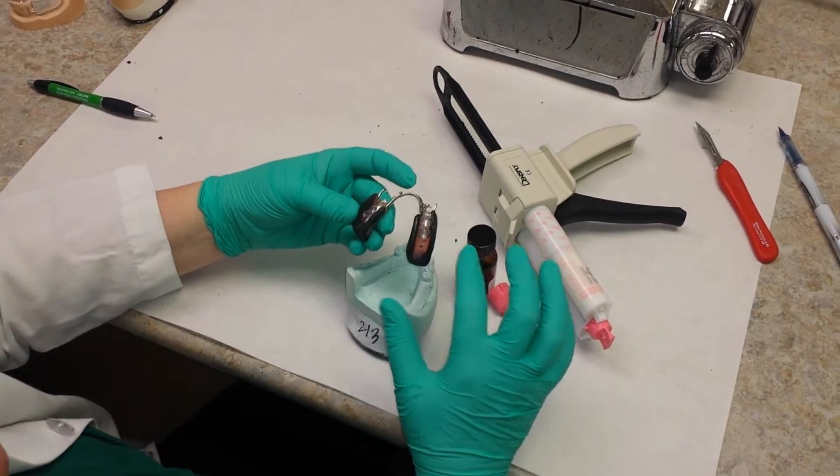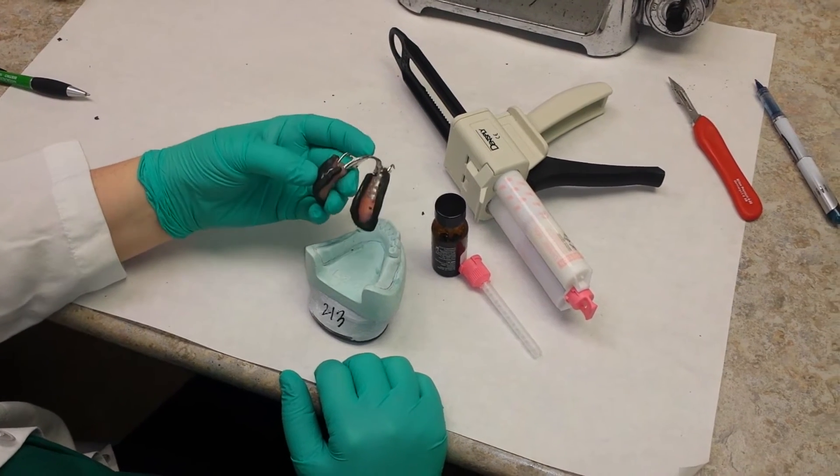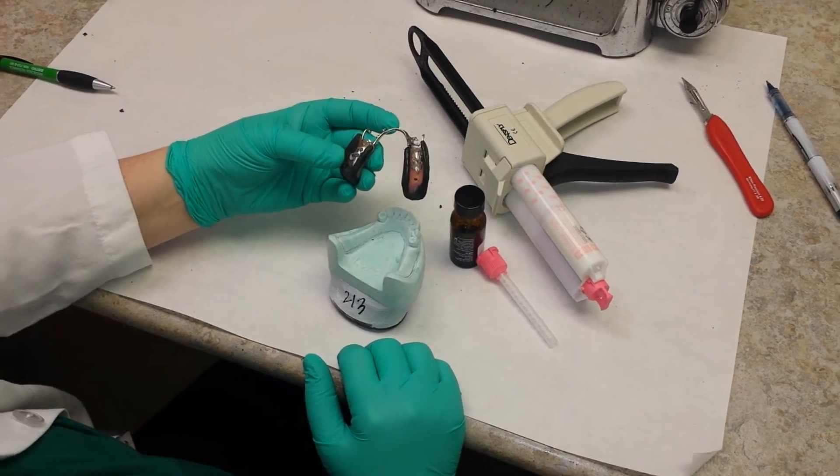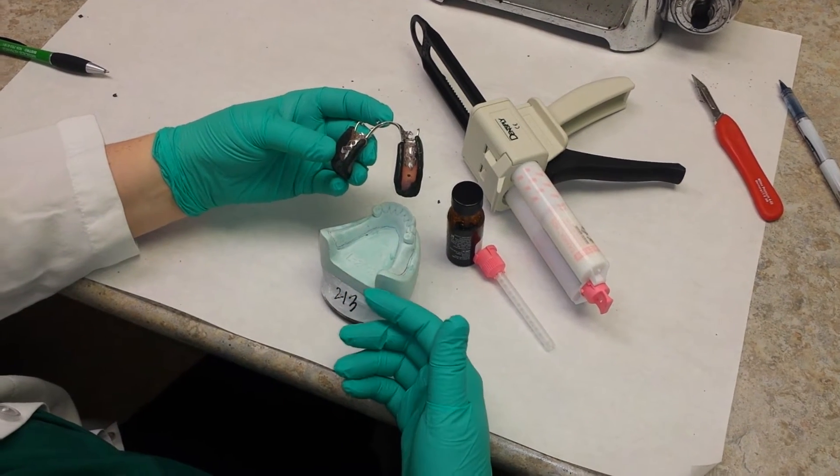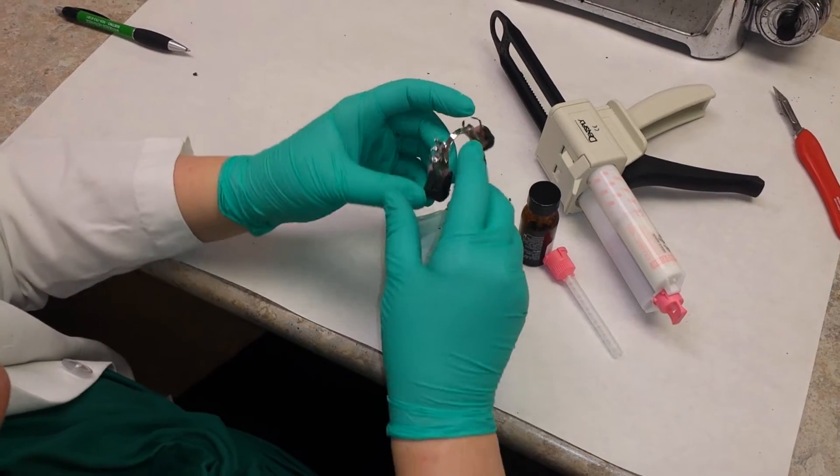We finished doing the border molding and trimming the border molding for the posterior sections on both sides. Obviously when you take the impression, you're going to take the impression on both sides at the same time. I mean, I guess you could do one side at a time, but it'd be a little hard.